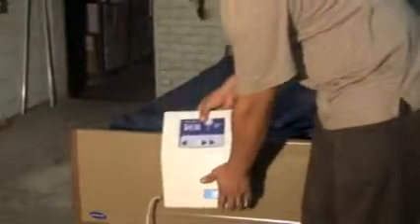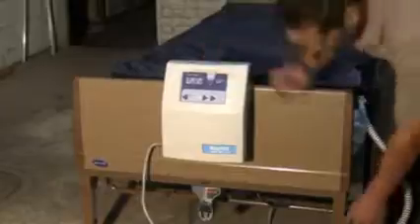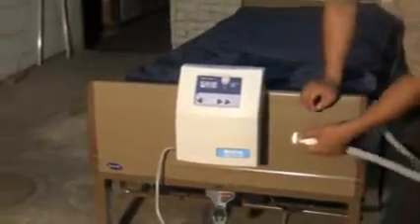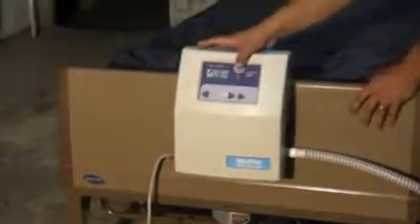Once your air filter has been checked and cleaned, you may resume your low air loss therapy as normal. Simply hang your unit from your footboard, connect your tube set to your air control unit, make sure your power cord is connected, and you may power back on.